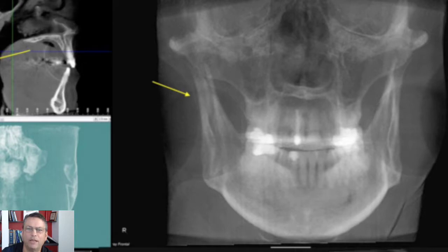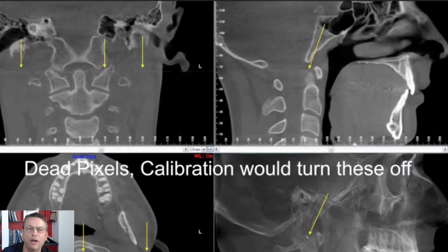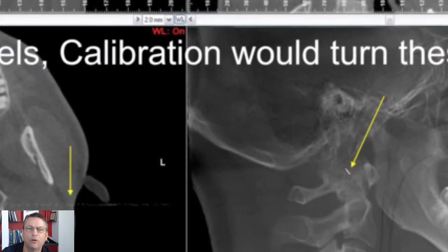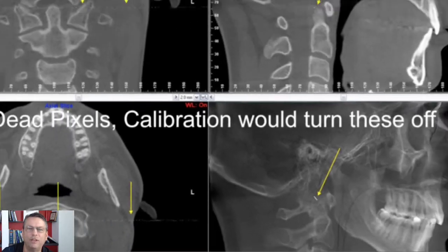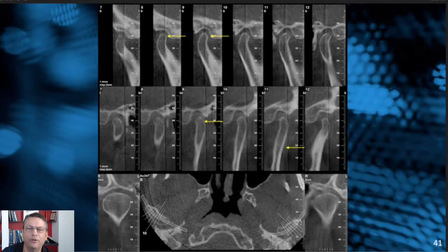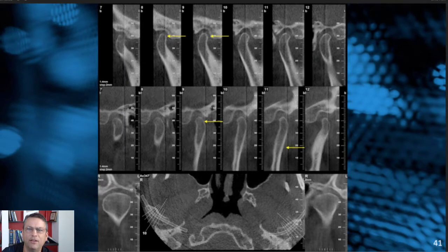The point is: calibrate routinely. Sometimes the computer will have a line of dead pixels on the sensor, and this is a calibration issue. Calibrating routinely would turn those dead pixels off and you won't see that line in your images. Other times, if you calibrate with something in the field of view such as the head positioner, you'll get a white or black line going across the image. All these things are calibration issues that can be eliminated by simply performing that one task.